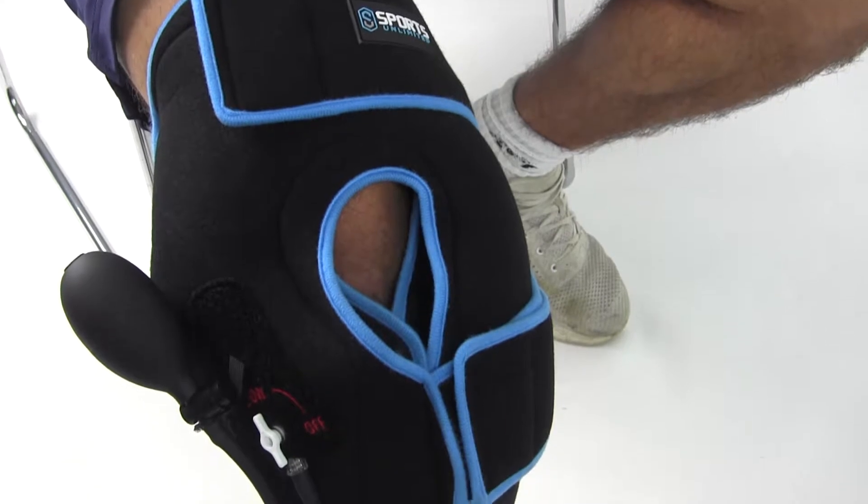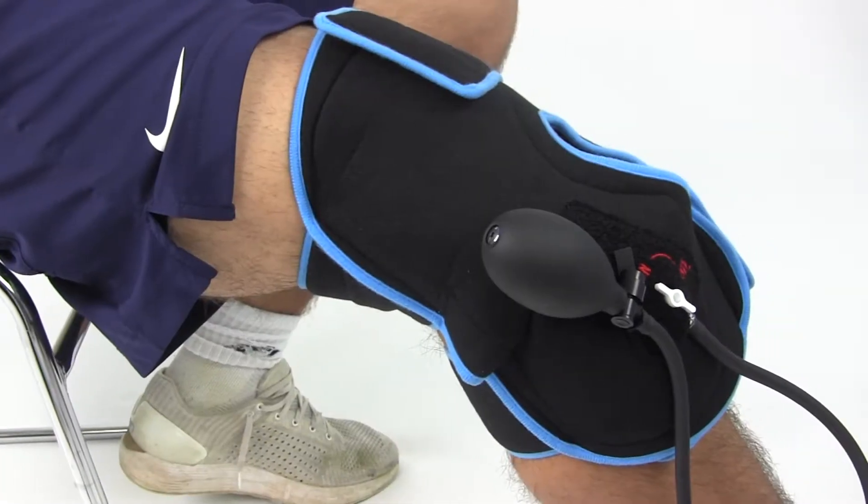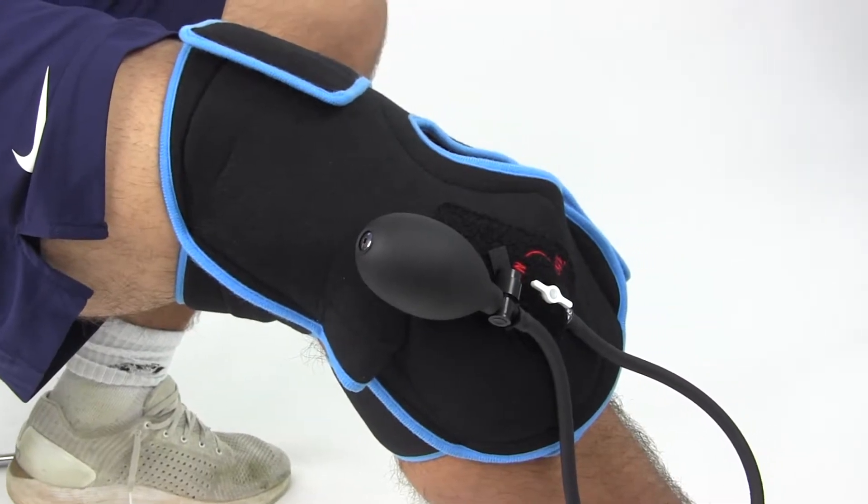Combine the benefits of cold and compression therapies with the Sports Unlimited cold compression knee wrap. The wrap uses temperature resistant material to stay colder longer.